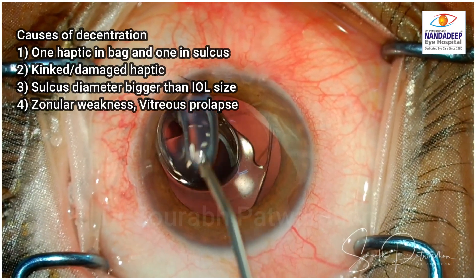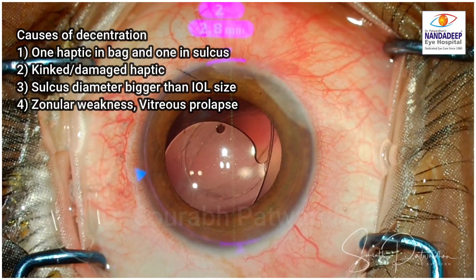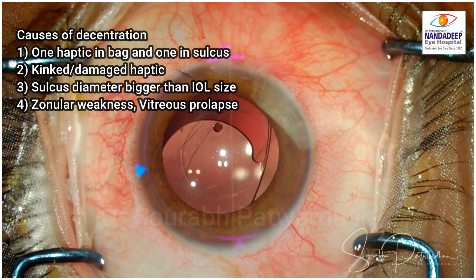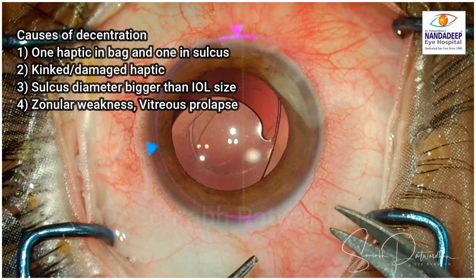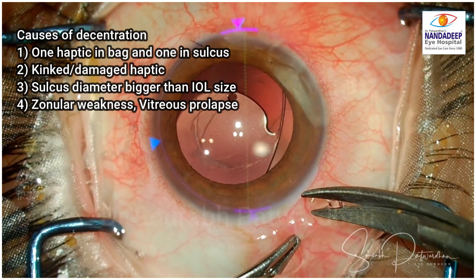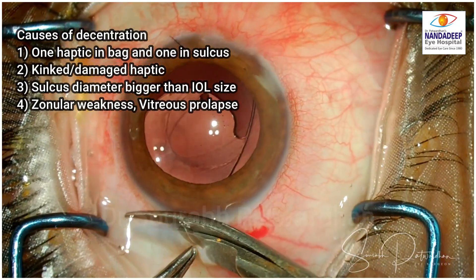What are the causes of decentration of this IOL? One haptic may be in the bag and the other in the sulcus, causing tilt and decentration. One of the haptics may be kinked or damaged, and the sulcus diameter itself might be bigger than the IOL size — this is a 12.5mm IOL and the sulcus might be bigger. Zonular weakness, lack of proper sulcus space, and vitreous prolapse can be other causes in this particular case.